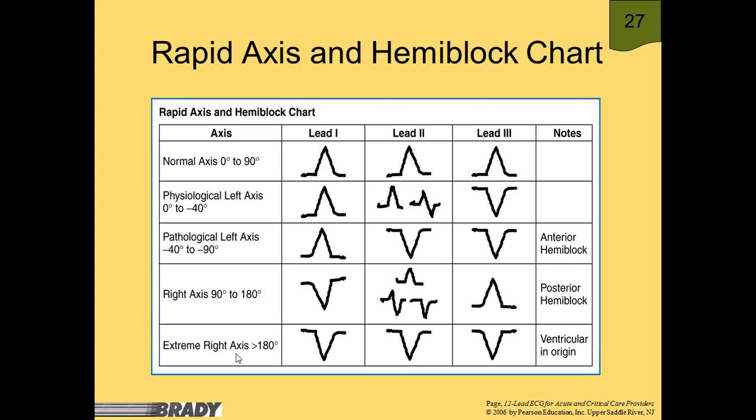And then your extreme right axis deviation is anything more than 180 degrees. We're going to see that negative deflection in all 3 leads because this is a ventricular rhythm, okay, most often VTAC.